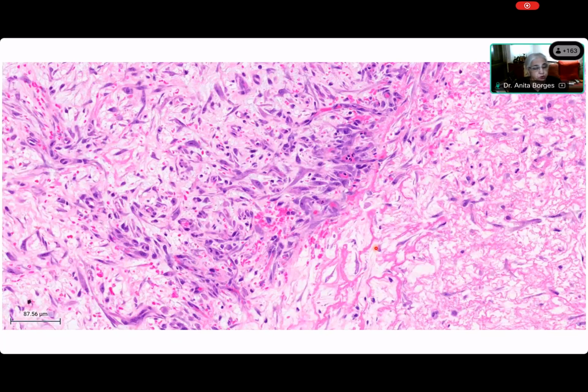And what is the cellular tissue made up of, Elsa? What is the principal cell that you are seeing over here? Ma'am, the stellate cells and extracellular material. Stellate cells. Yes, absolutely. The stellate cell, that is the principal cell that you're seeing over here. So we have a lesion in which you have mainly stellate cells and very few spindle cells.